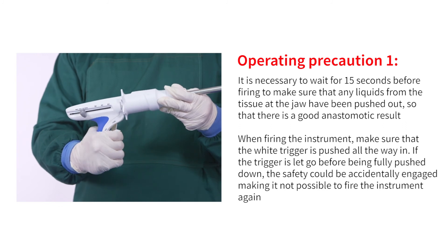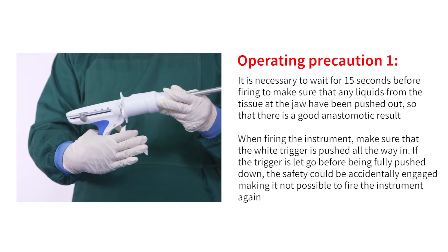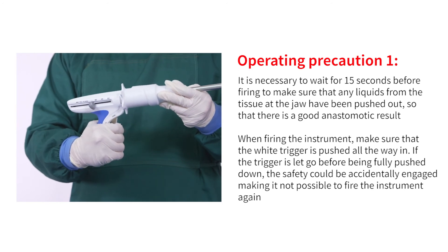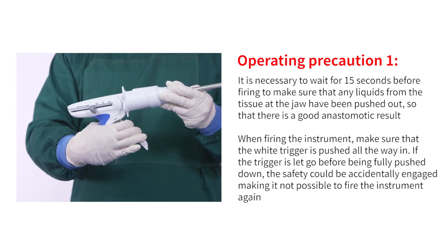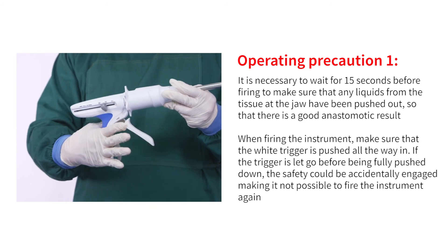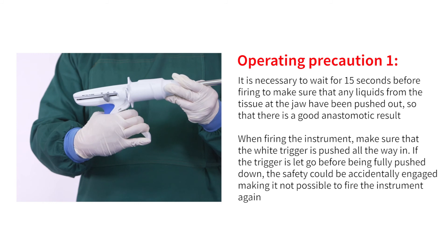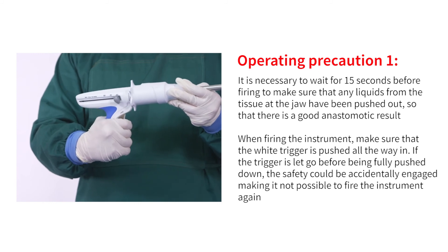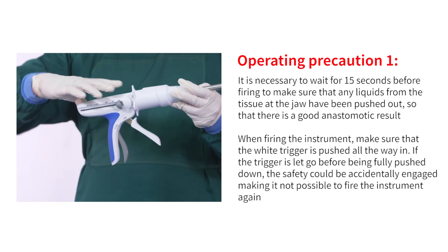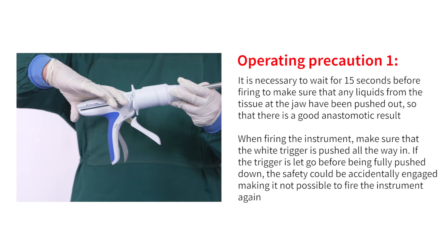Operating precaution one: wait 15 seconds before firing to ensure that liquids from the tissue at the jaw have been pushed out for a good anastomotic result. When firing, make sure the white trigger is pushed all the way in — if the trigger is released before being fully pushed down, the safety could be accidentally engaged, making it impossible to fire again.